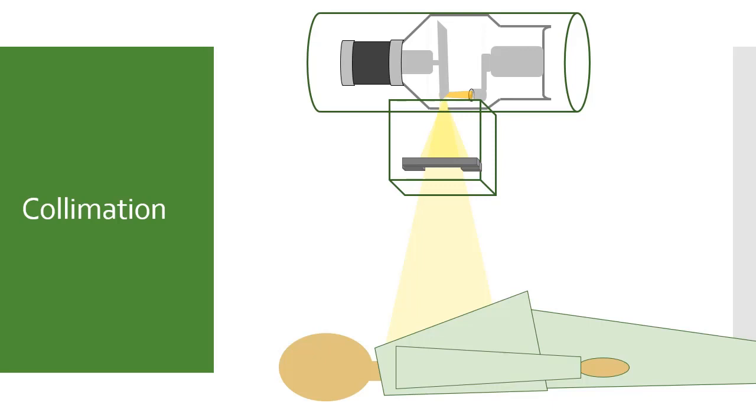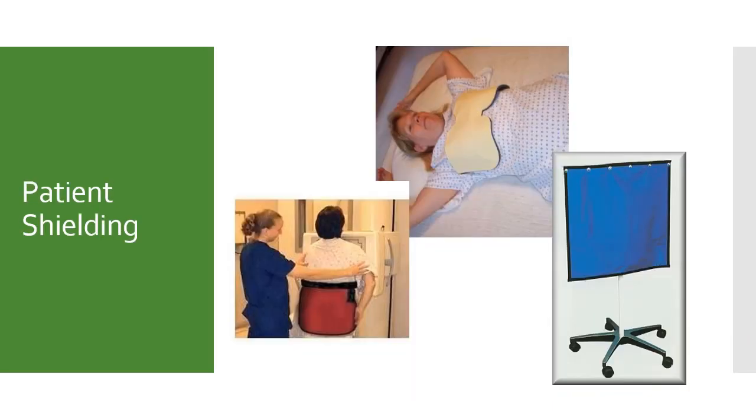It is the interpreting radiologist or radiology group that determines the standards and protocols in the department for radiographic examination, and this includes collimation. Generally, collimation should be approximately 1/2 inch beyond the skin line or the area of interest. Another easy practice that helps reduce patient dose is shielding. There are many types of lead shielding available in order to protect the patient's body from radiation.